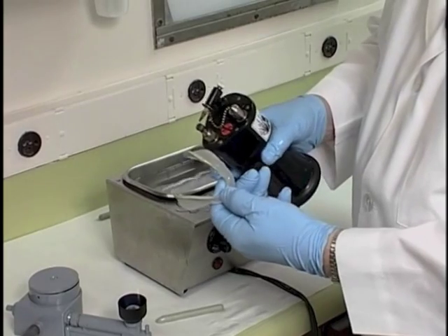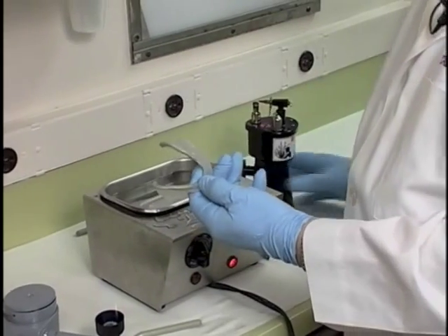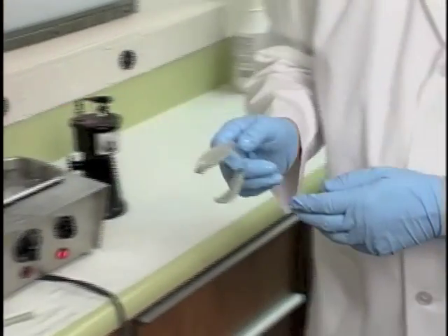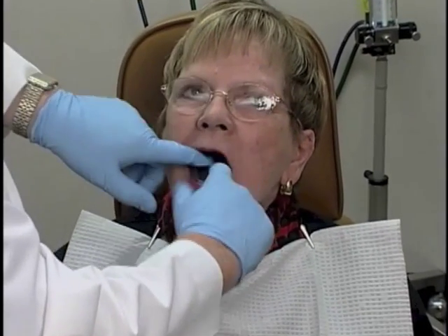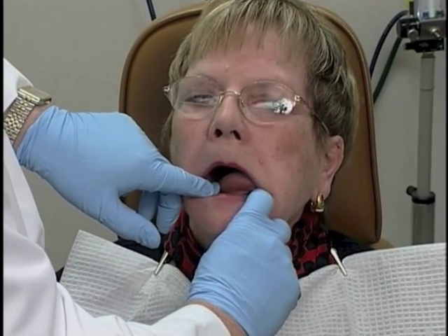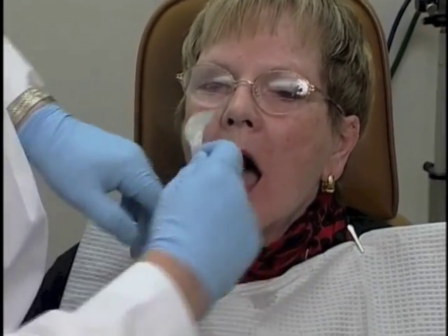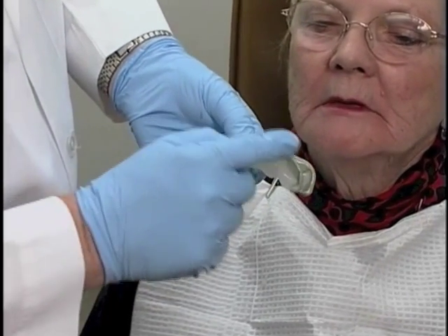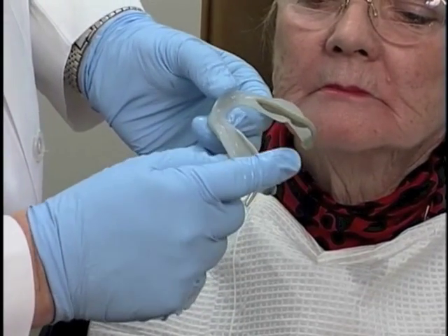Then we take our torch and we superheat it to make sure it is good and soft. Once the material has been heated with the torch, we're going to go back to the mouth again and rotate it into the mouth. Place your tongue straight out at me, good, and into your left cheek this time. Very good. Now relax. And again, we have a good border molding in that we have a very nice rounded periphery without tray showing through. It's an excellent border molding at this point.